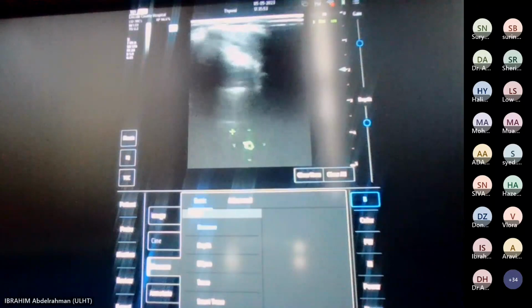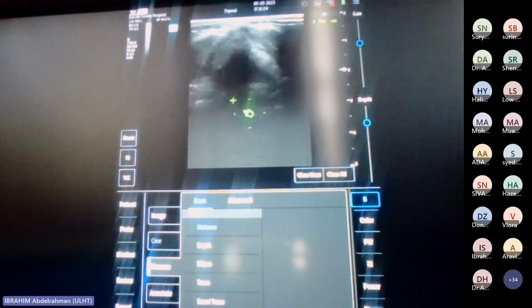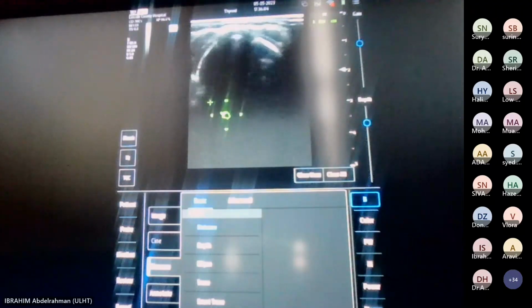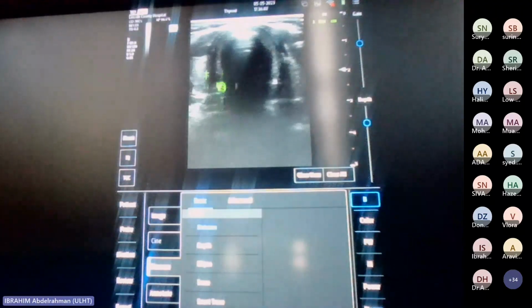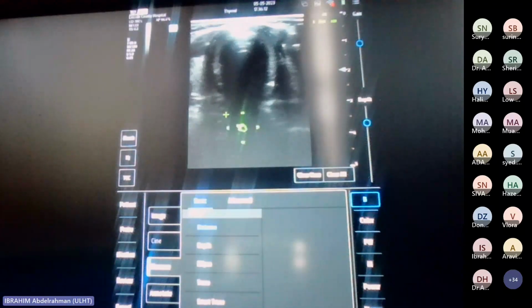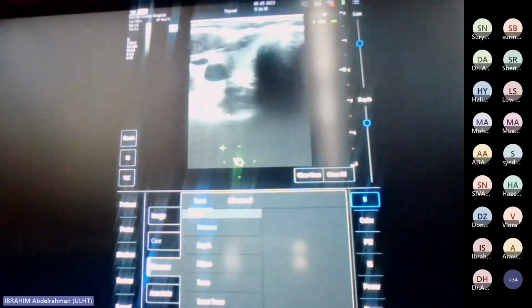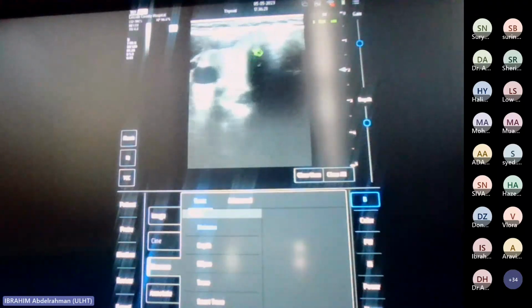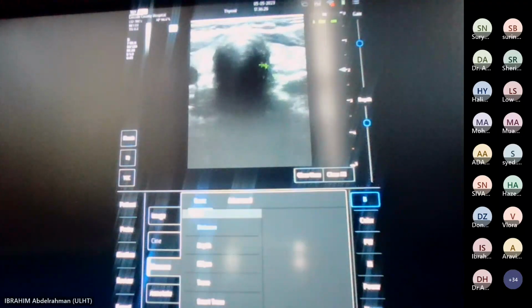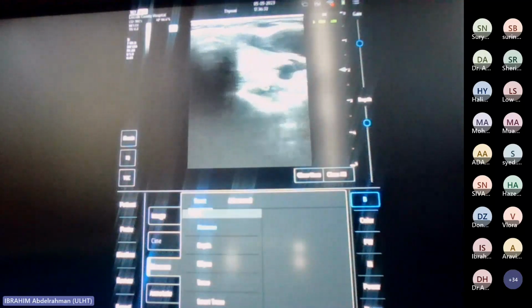Once you get past the paraglottic fat, then you can sometimes see the true cord there. You can just see maybe the arytenoid on this side. As we come down, we will then get to the cricoid cartilage. We can't see the posterior aspect of it, we can see the anterior aspect of the cricoid cartilage there, and then we will get to the thyroid gland. So 2 lobes, no thyroid nodules here. So right lobe, isthmus, left lobe. Also see the trachea in the middle and the esophagus just sitting to the left-hand side there.